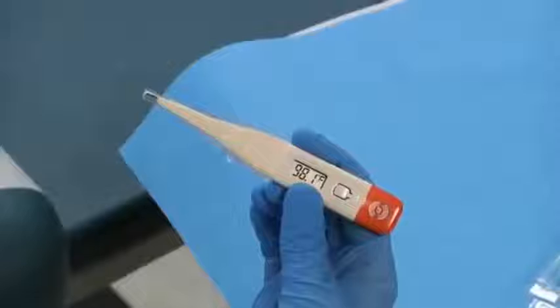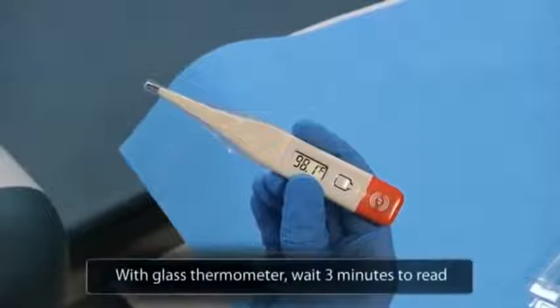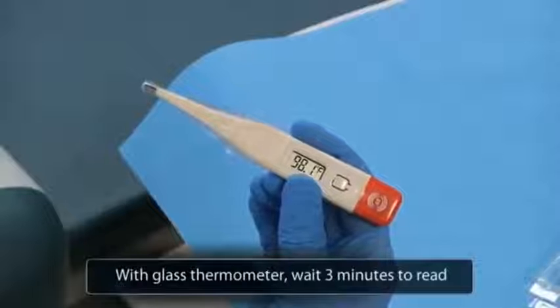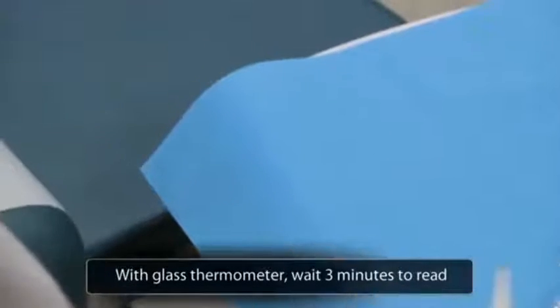Insert the thermometer about 3 to 4 centimeters, or 1.5 inches, into the anal canal in a direction pointing to the umbilicus. Remove it after the recommended time period, then read. As opposed to this electronic thermometer, the process with a glass thermometer is the same, although you must wait 3 minutes to read the results.